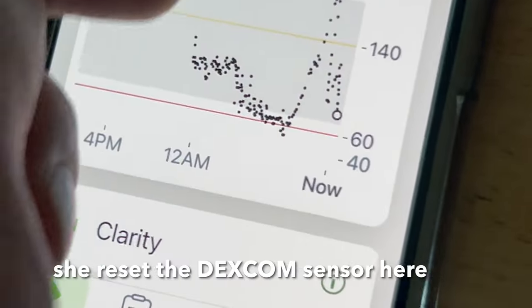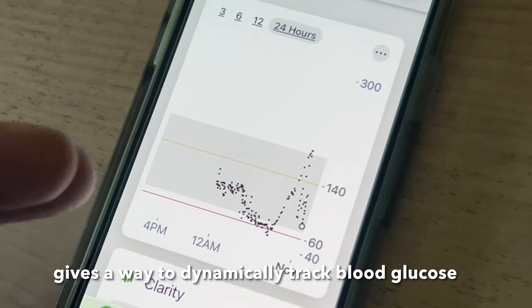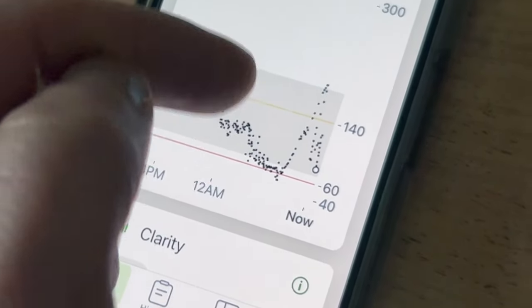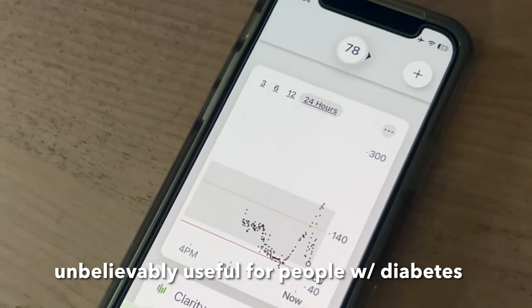She reset the Dexcom sensor here. What this does is it gives you a way to dynamically track. That's the low cutoff — the red line — and the yellow cutoff is where it gives you an alarm on either side of the yellow or red. So this is unbelievably useful for people with diabetes.